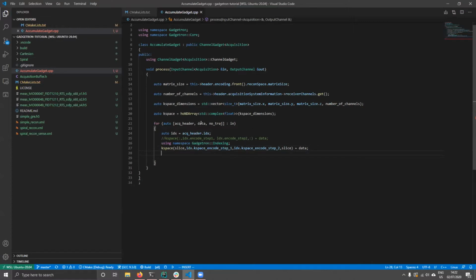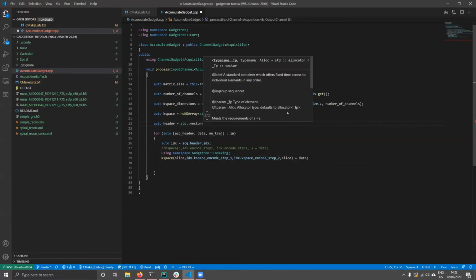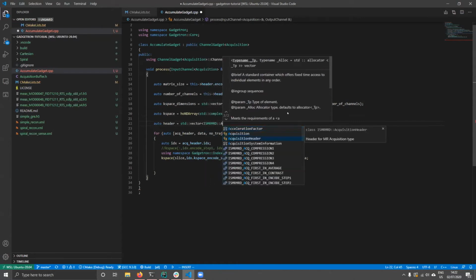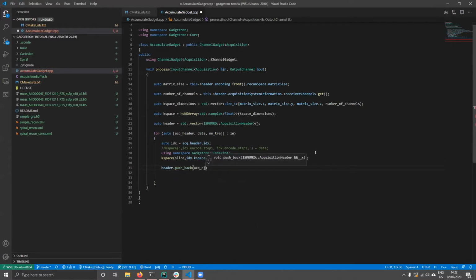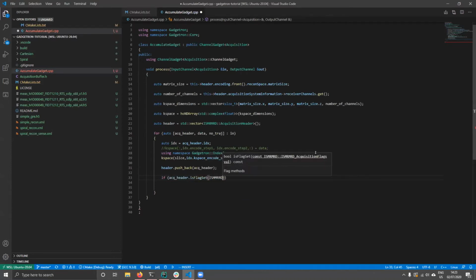The next thing we want is we want to save the headers. We're going to need them later when we're doing reconstruction. So let's make a list to put those in. Finally, we need to figure out, are we done? Are we ready to send this k-space buffer on to the next gadget? So we will ask the header nicely if it has a specific flag set.